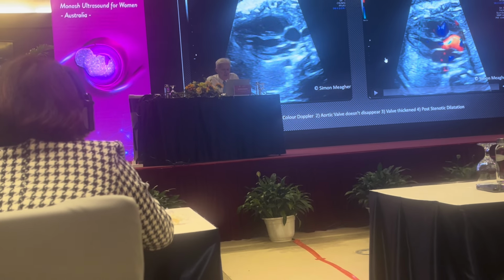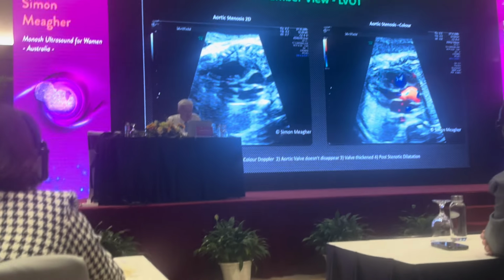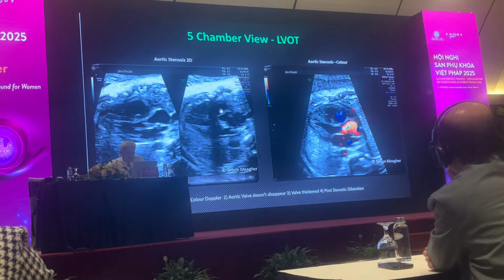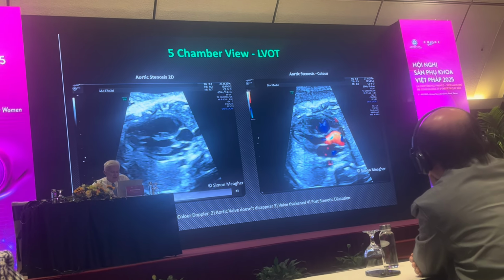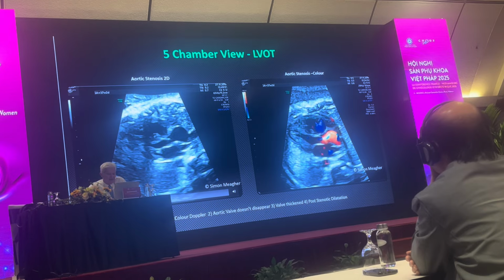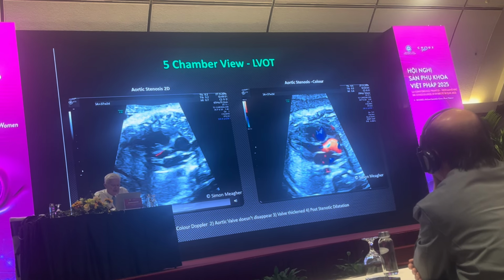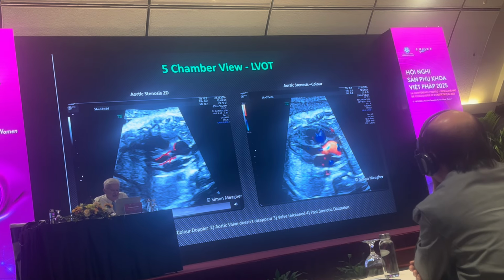And you see there are two things which I do not like. Number one, when I look at the aortic valve, it does not disappear during ventricular systole. If I slow it down very, very slow, you see that when the aortic valve opens, you can still see the valve, it is thickened. And the second thing is when you look at this, you appreciate that the aorta is narrow here, with a thick valve, and then it dilates here.